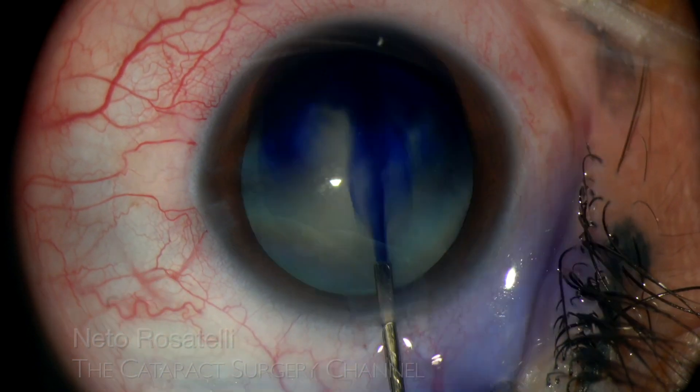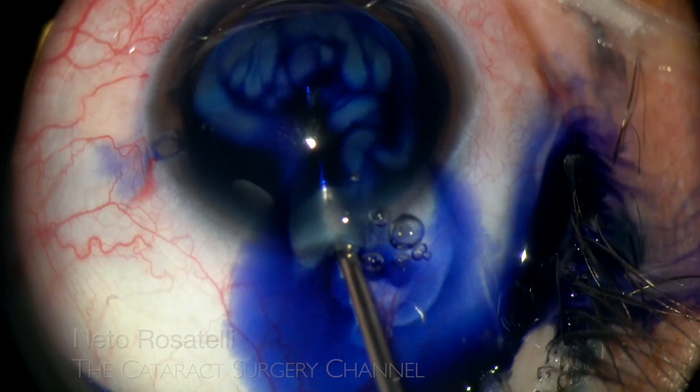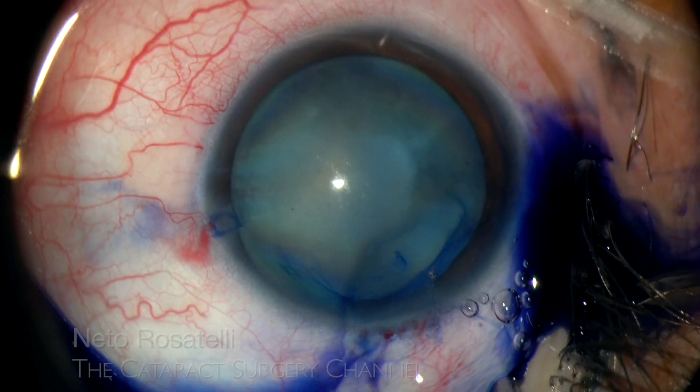I prefer to remove the dye using dispersive OVD, skipping the step of washing using BSS. A nicely stained capsule is obtained.